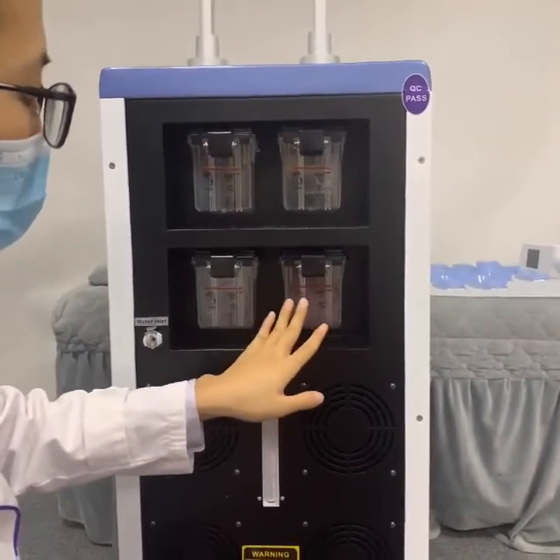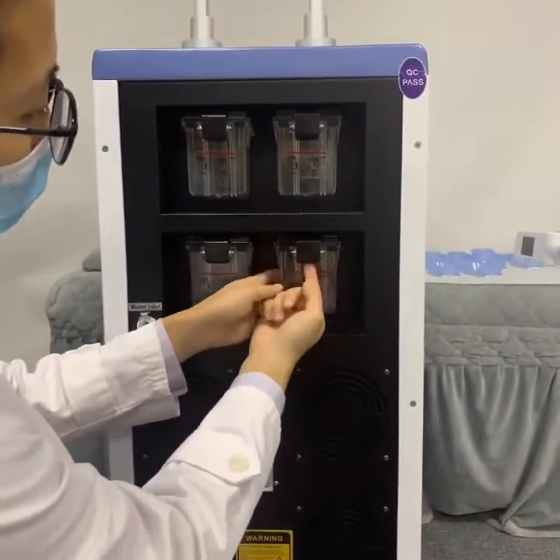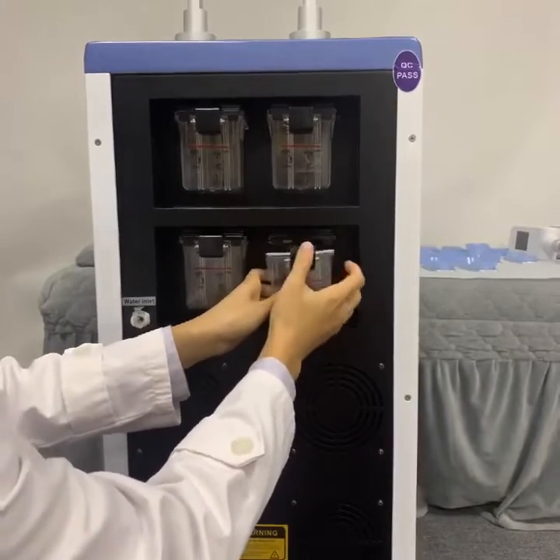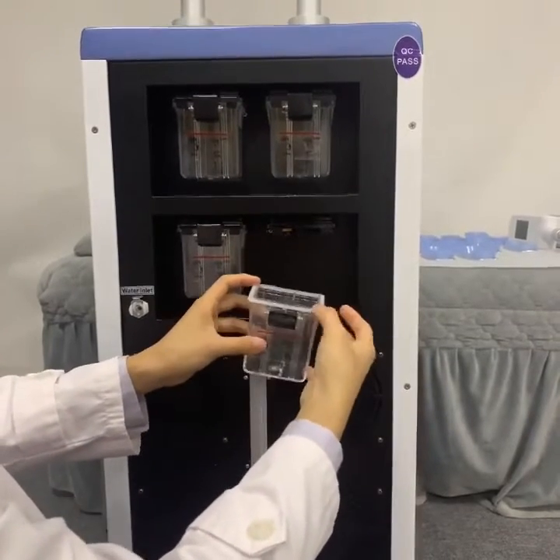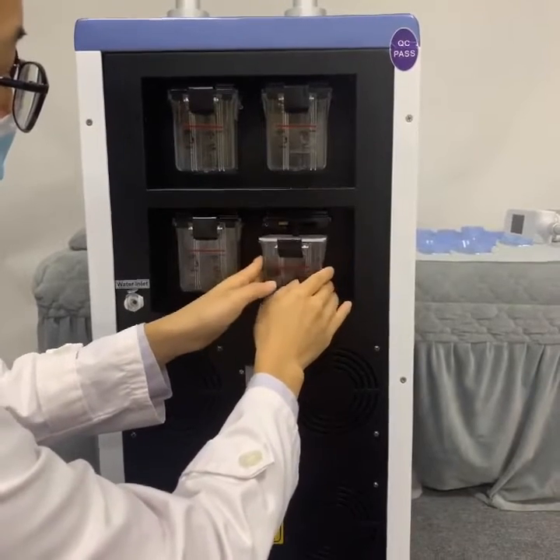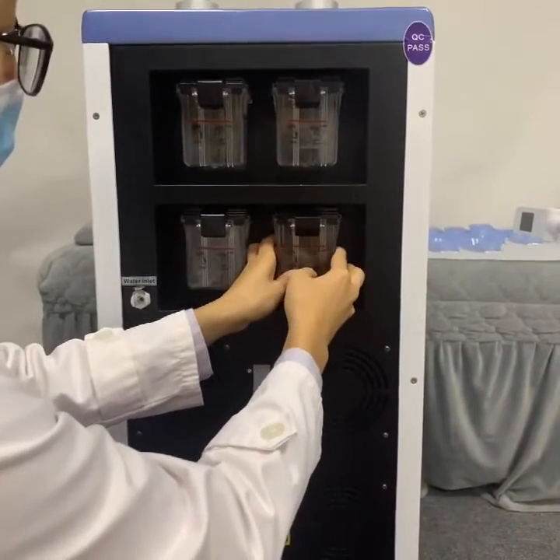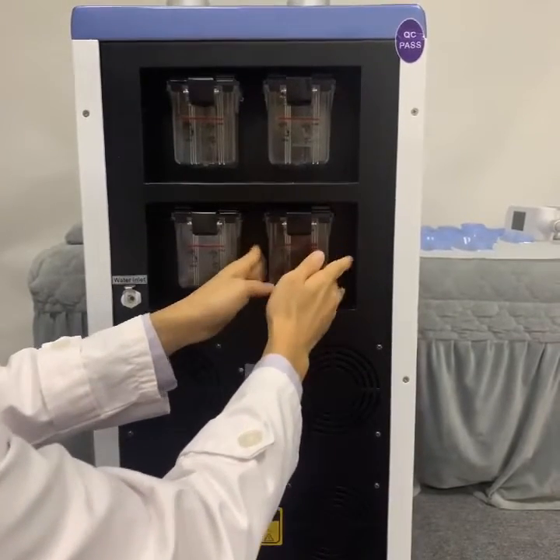Next, we will show how to clean the wastewater bottle. First step, we have to use our finger in this position and then pull out this black button, then remove the wastewater bottle. After cleaning it, please make sure this rubber is here — otherwise it will influence the vacuum for this machine. Then put this water bottle back here, make it to the right position, and press in this black button.